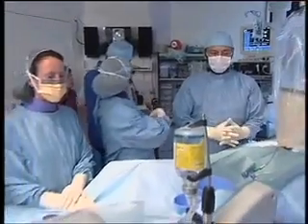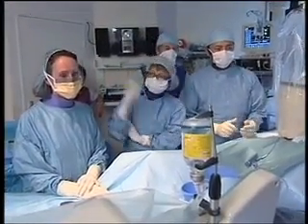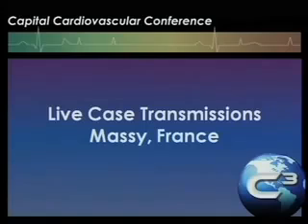everybody in the cath lab. Dr. Farge as an anesthetist. And Marie-Stella as a nurse. And Thierry as nurses. So can we have the story of the patient?